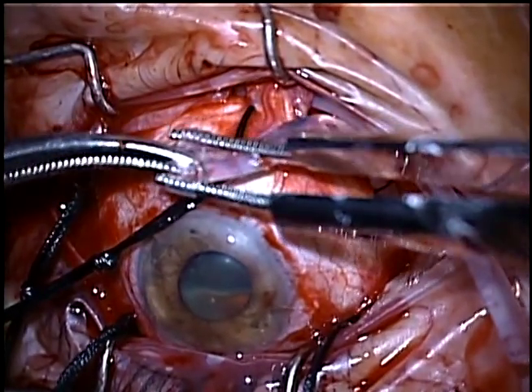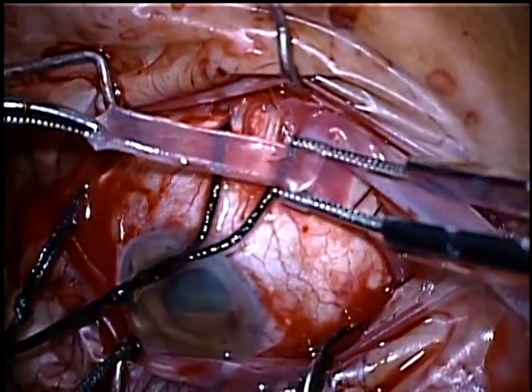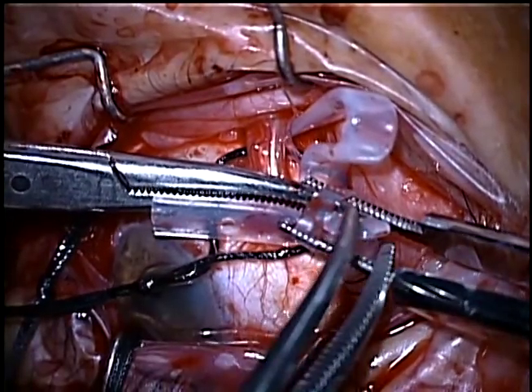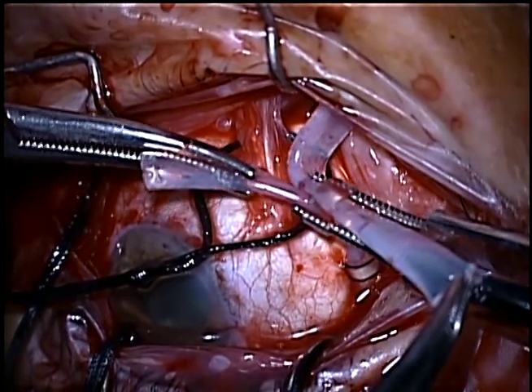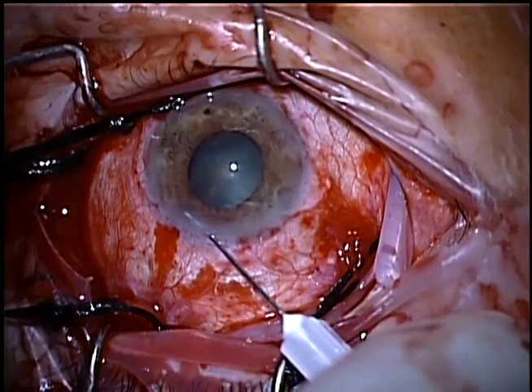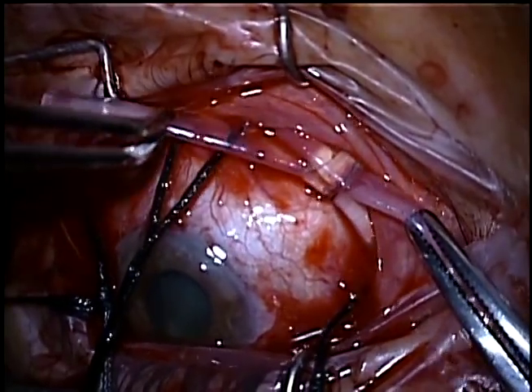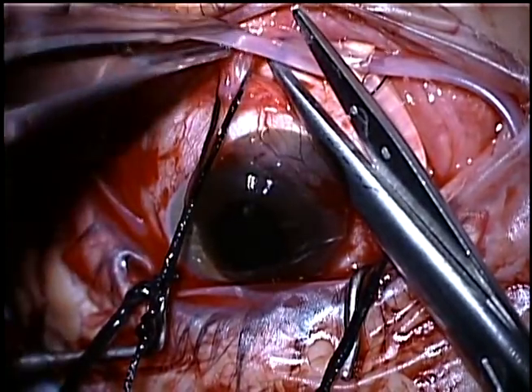Here we join the two ends of the band with a sleeve, a silicone sleeve. In this case, because the retinal detachment is very shallow, we'll remove some fluid from the anterior chamber with a 30-gauge needle to soften the eye and make room for the buckling effect as we pull the scleral buckle up into place, which we do now. Trimming the ends of the band.